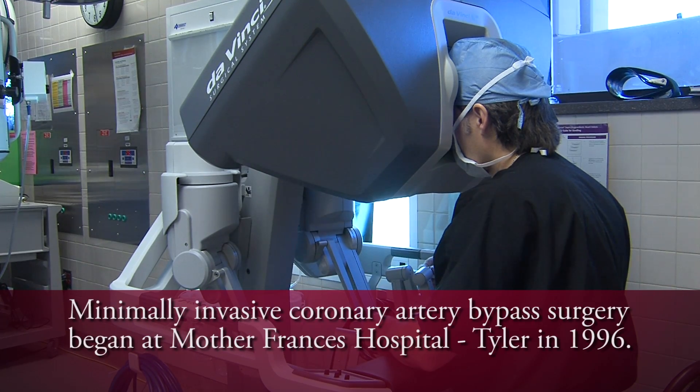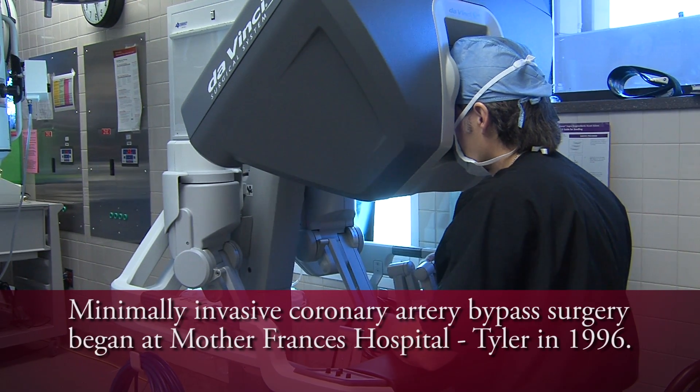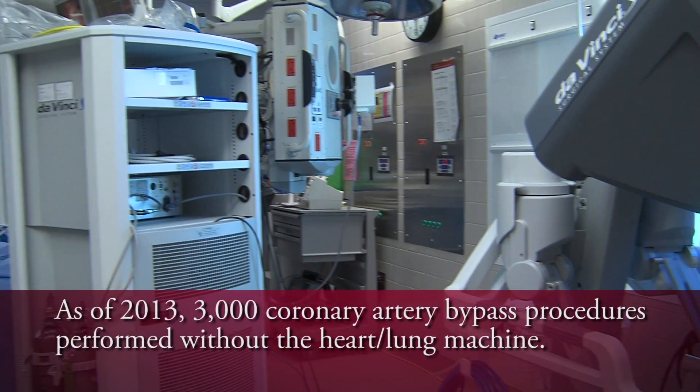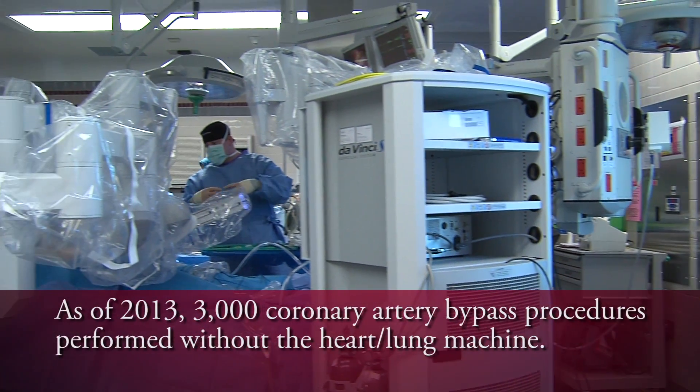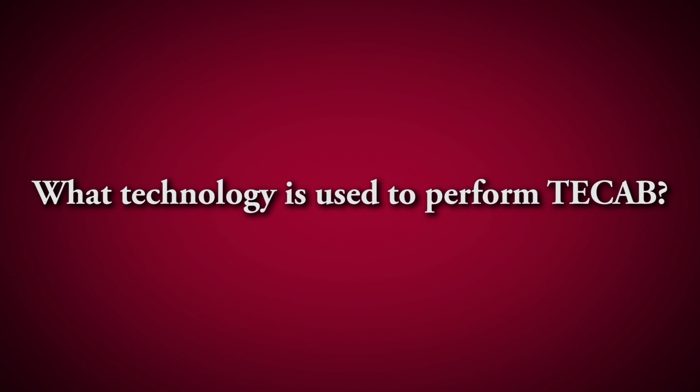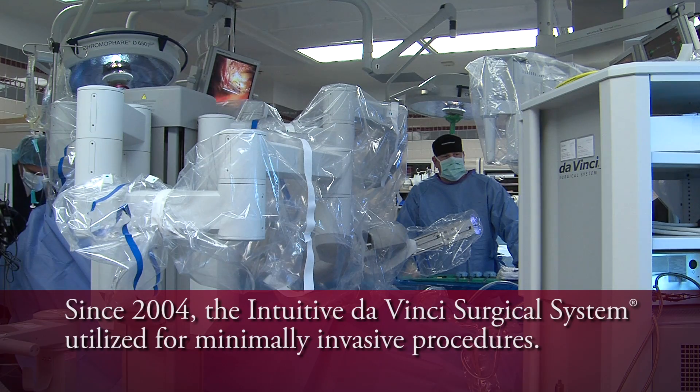We began doing minimally invasive coronary bypass surgery in 1996. As of 2013, we have done close to 3,000 coronary bypass procedures without the use of the heart-lung machine. The technology we use to perform T-CAB is the Intuitive DaVinci robot, which we have been using since 2004.